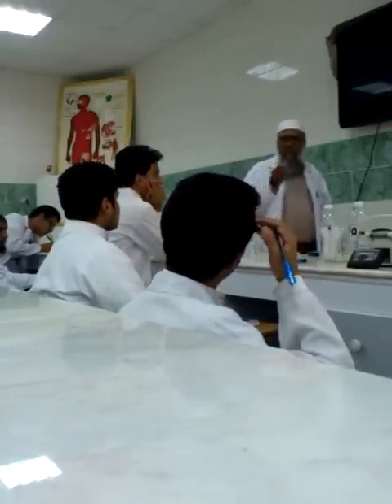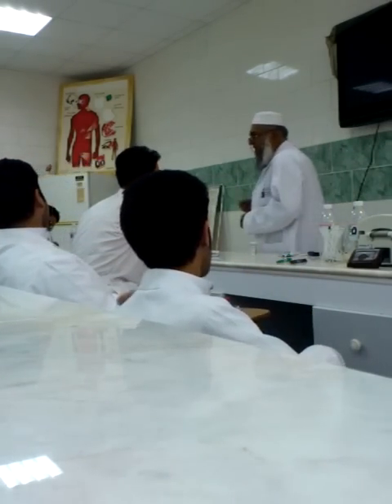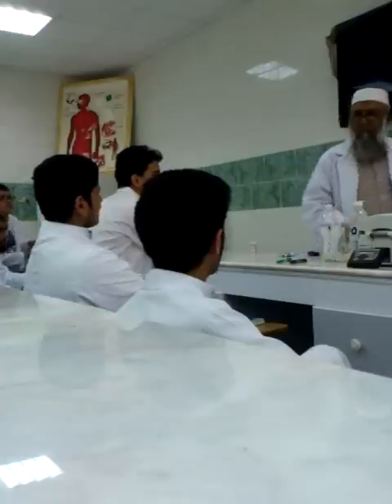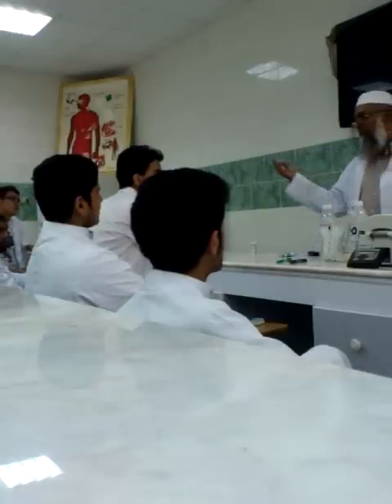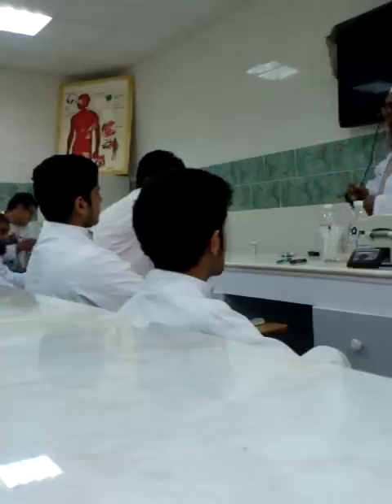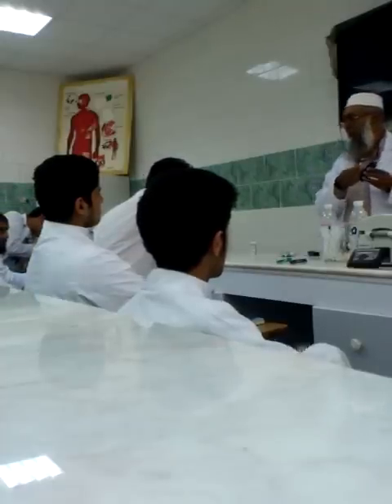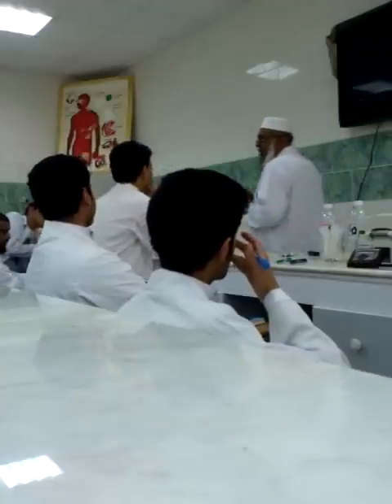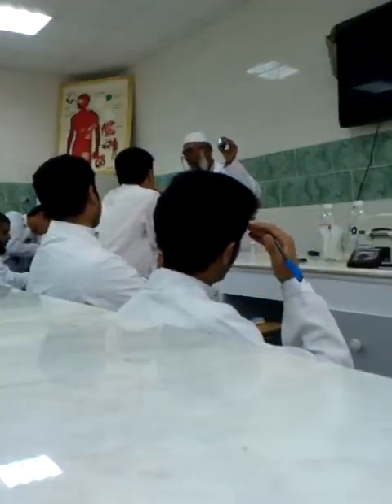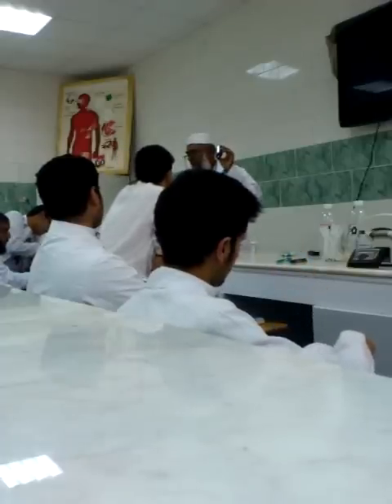So don't put the blood drop as usually the students do in the exam, that they put the blood drop first here and then now they are trying to put it inside the glucometer. Until and unless you first introduce the strip, let the meter be ready, and then put the drop of blood, only then will the value come. Okay? Clear? Yes.